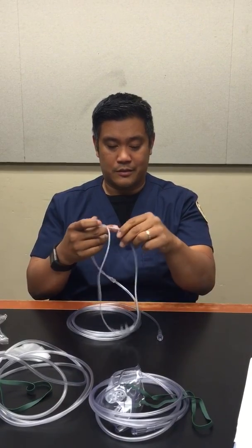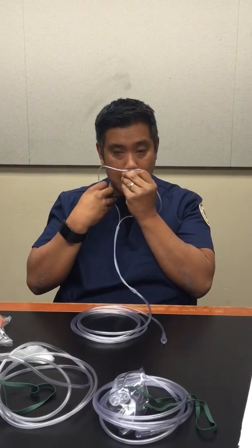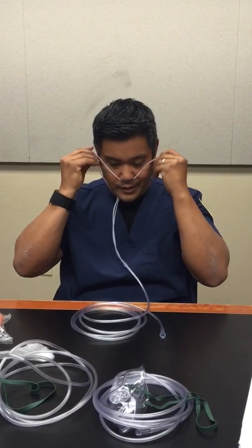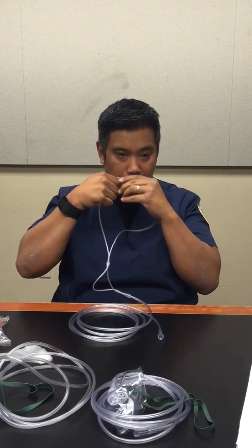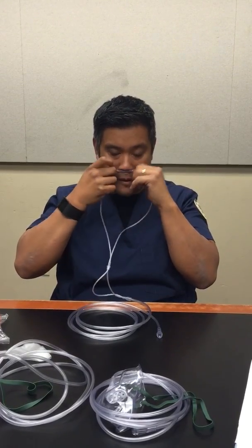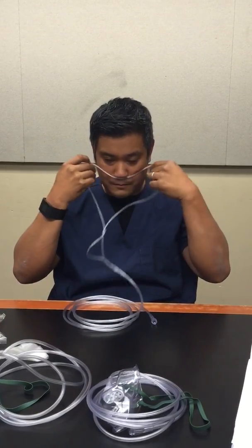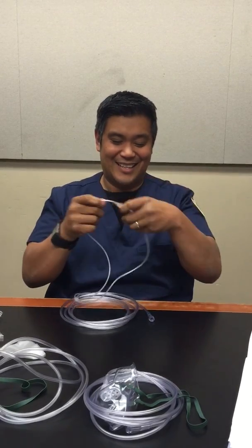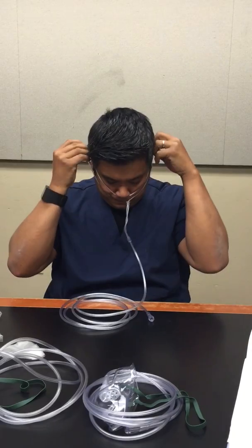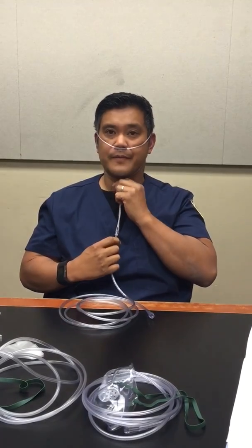To place this on the patient, you would place the prongs downwards, place this over your ears, and you would tighten this to fit. And that's basically how it attaches.